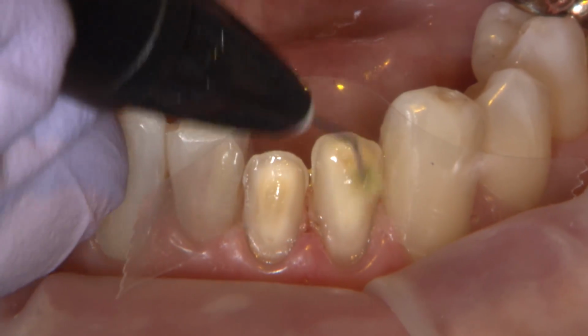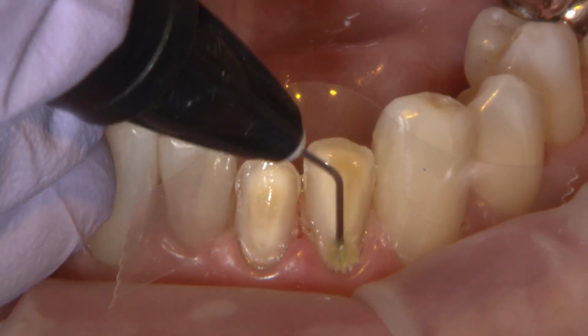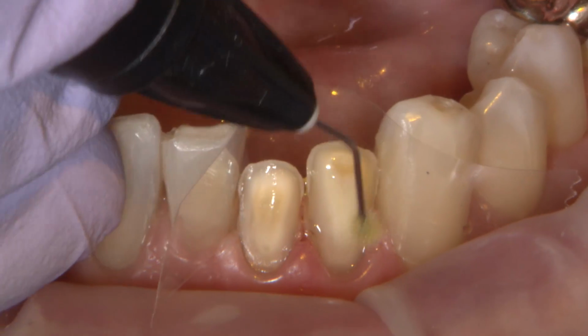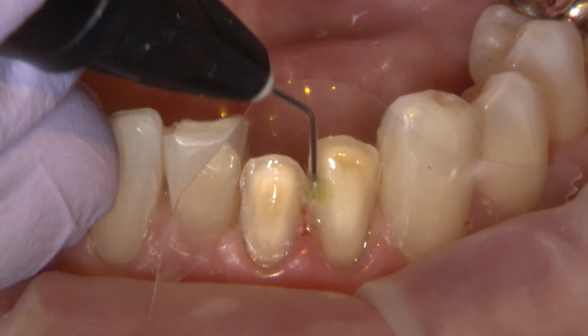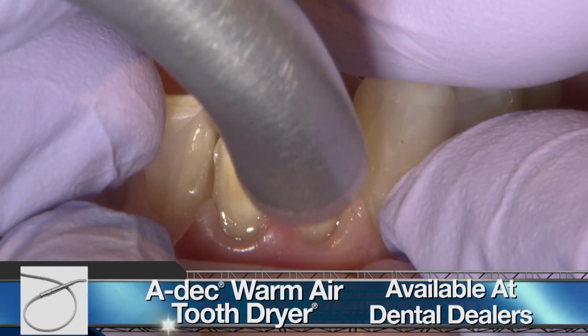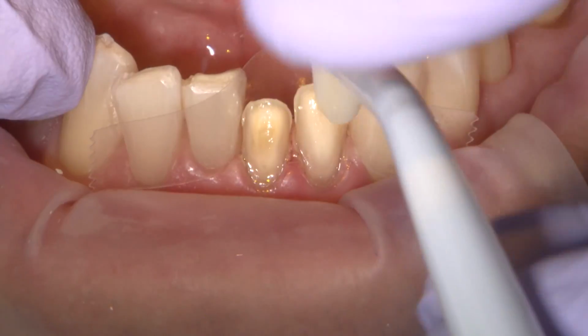Using the brush-tipped applicator, ensure that the bonding agent is applied to the enamel surfaces and then is scrubbed really well into the dentin to ensure that the resin monomers can penetrate into the collagen matrix. And this ensures that we have a good hybrid layer formation. Gently air dry the bonding agent to thin it out, and we want to also ensure that any solvents that remain have evaporated.